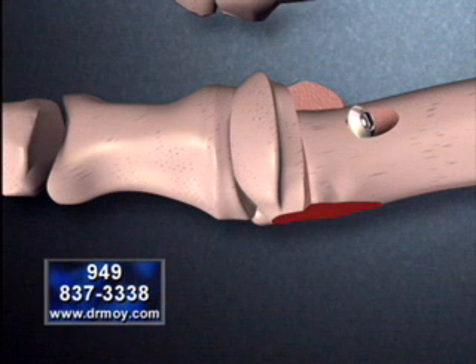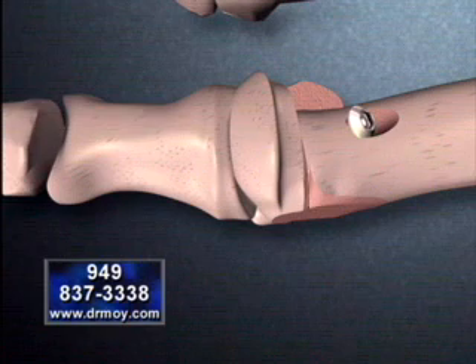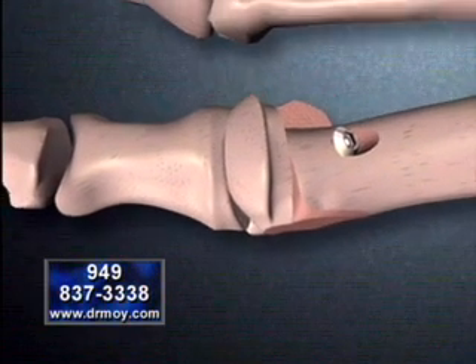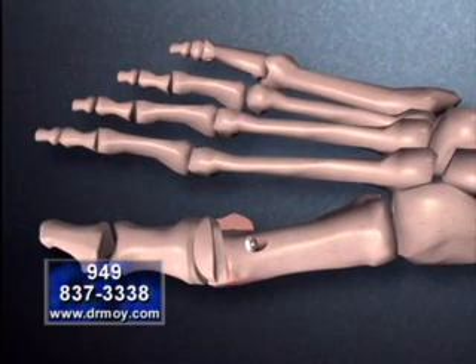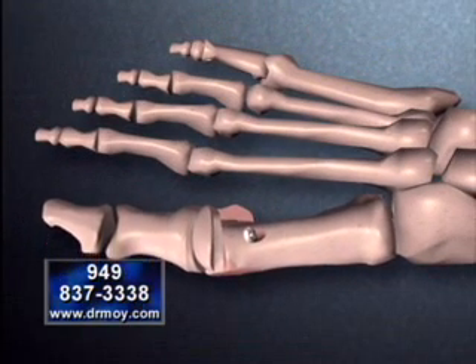The remaining shelf of bone is then removed, and the edges of the bone are polished smooth. Now that the great toe joint has been realigned, the long bone may reposition itself to near normal anatomical alignment.